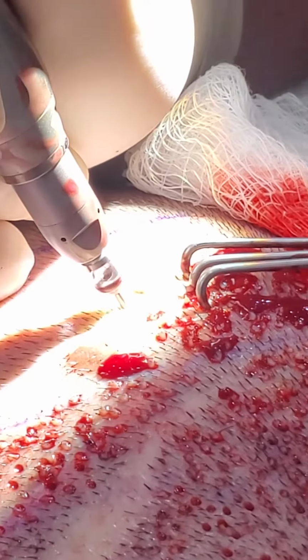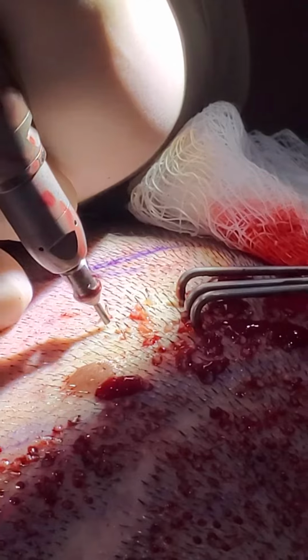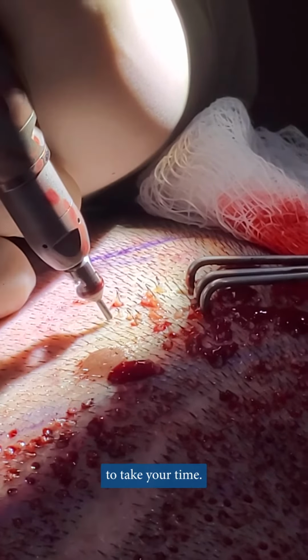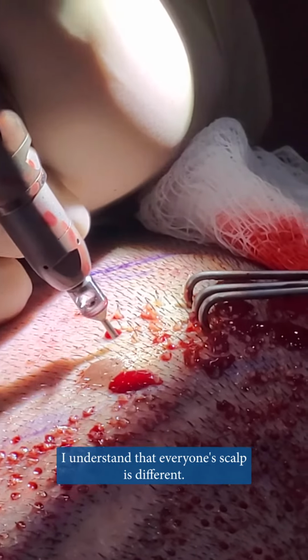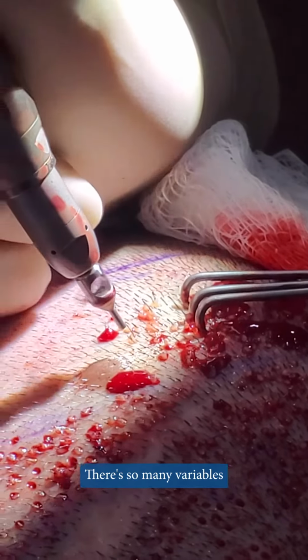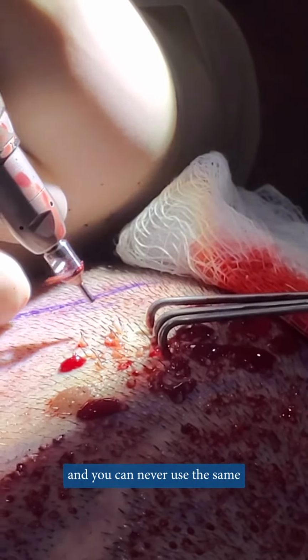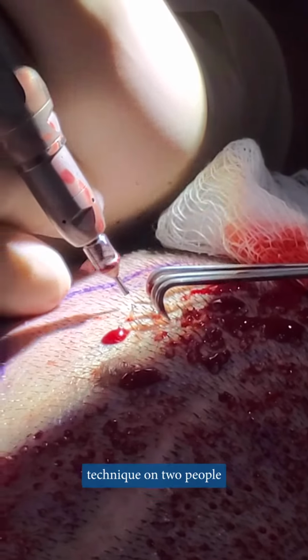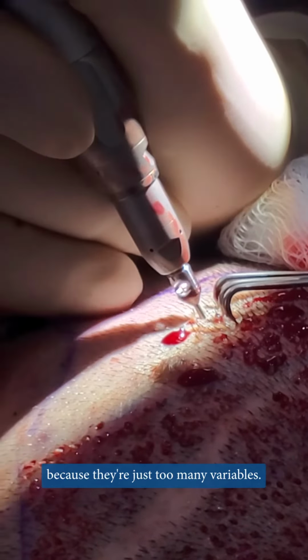There we are. And this is the trick, I think, really, with FUE surgery: to take your time, be accurate, understand that everyone's scalp is different. There's so many variables, and you can never use the same technique on two people because there's just too many variables.